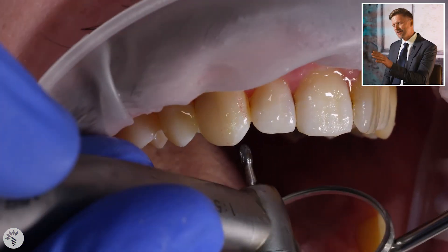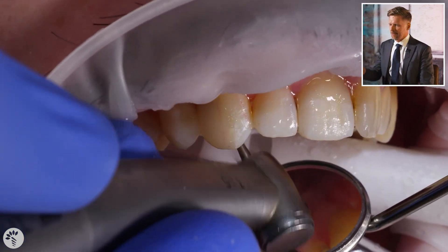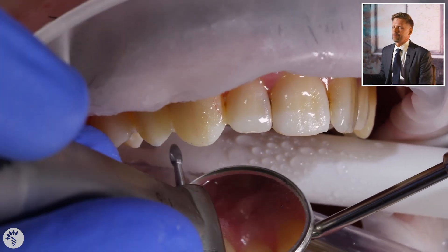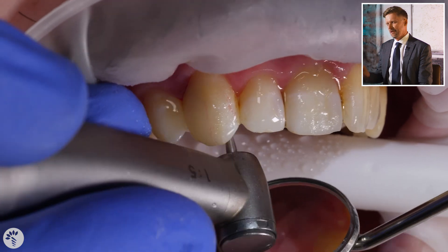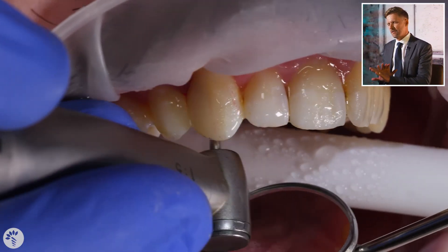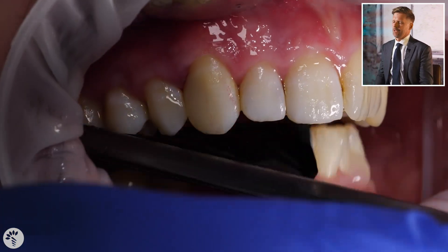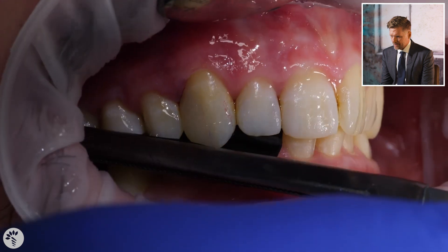Don't be timid when doing occlusal reduction — you'll end up making the most delicate little ballerina adjustments and be there for an hour. Look at how high the teeth are apart: if they're like half a millimeter, just grind half a millimeter off. That's half of a real millimeter, not a dental millimeter — dental millimeters are like ten to an actual millimeter. If it's slightly low the patient will live, the tooth will erupt into position. If it's high, it causes lots of problems — occlusal loading is the main reason restorations fail.